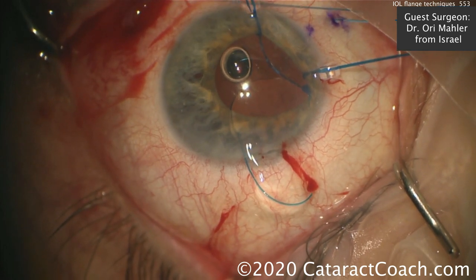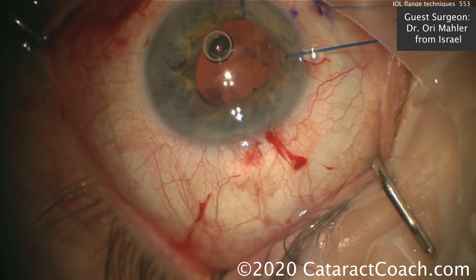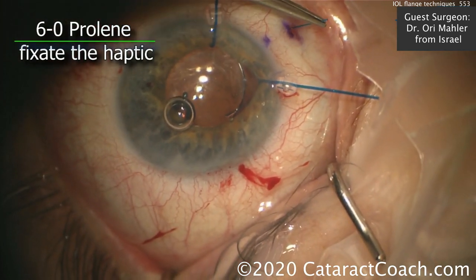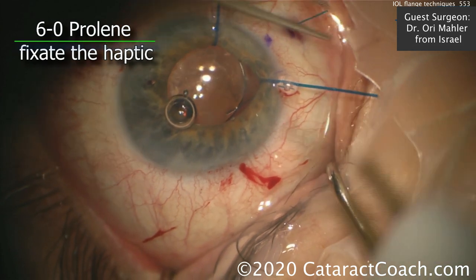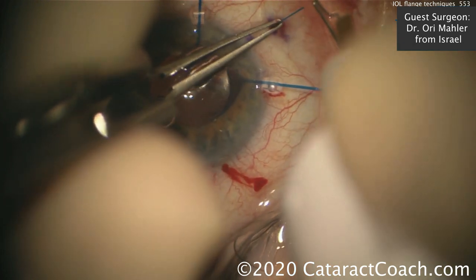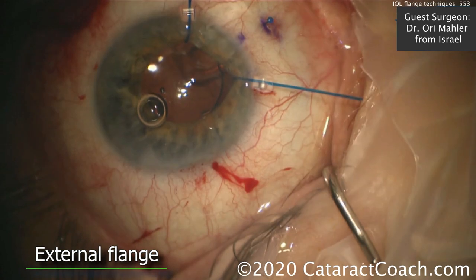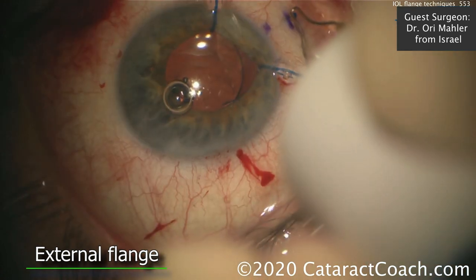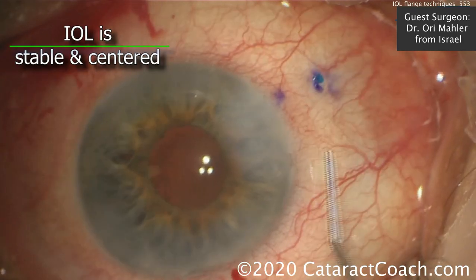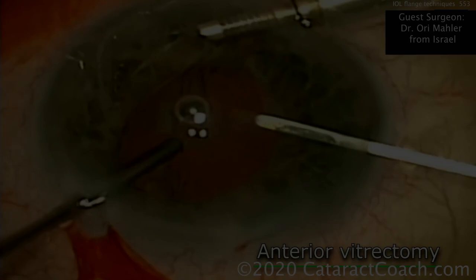That looks great. The trailing haptic can be placed at the sulcus because that part of the zonular support is still intact. For the other part with weak support, we've trimmed down that support suture. We hold on to the tying forceps and use the cautery again to create another flange. That flange can then be tucked underneath the conjunctiva, and that acts as a support — a very strong support. At the end of the case, the eye was stable and centered.